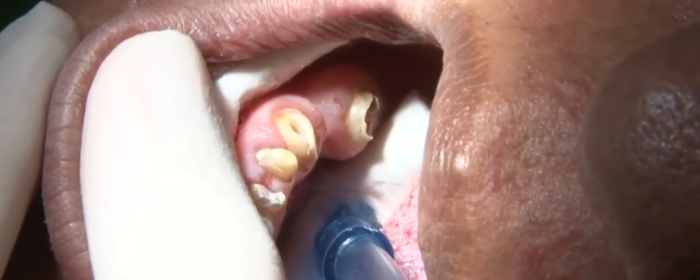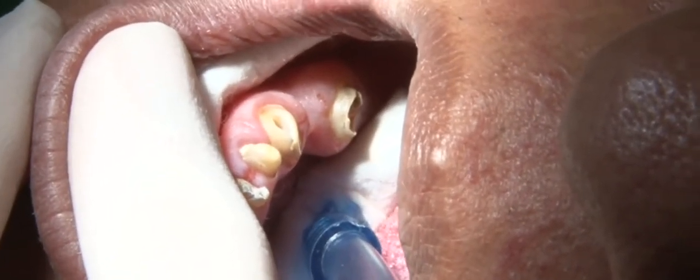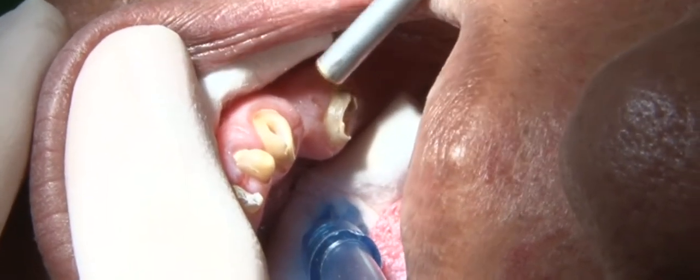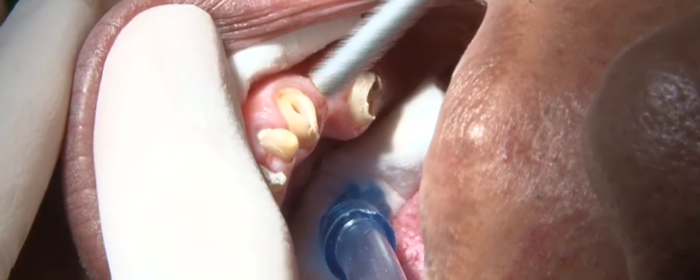Apply this mix on the tooth in a similar manner for 20 seconds and air dry gently. It is advisable to use a dual curing bond instead of a light curing bond. If a light curing bonding agent is used, the light may not reach the apical part of the post space, causing insufficient curing of the bond. The tooth should have a wet appearance at this time. Now, I am ready to inject the Luxa Core Dual.